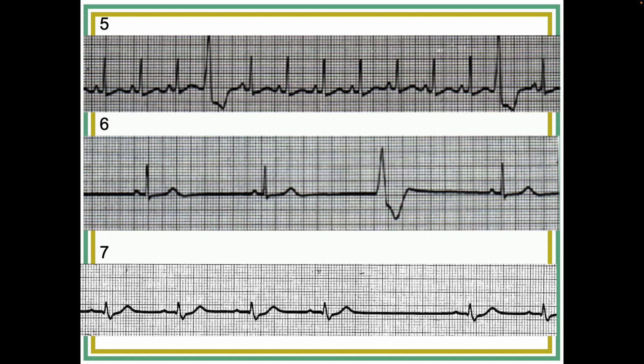A lot of that has to do with the shape of the QRS. We're not going to get to this for another 2 weeks. But in this case, it's a wider QRS, so it's going to be a premature ventricular beat. For now you don't need to know that yet; in a couple weeks you will, but for now we're just recognizing it as a generalized premature beat.